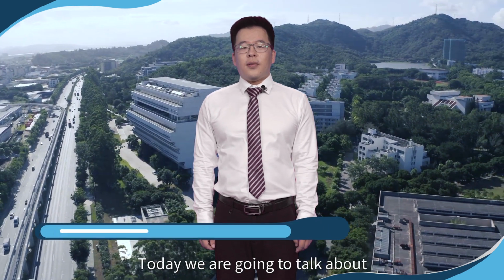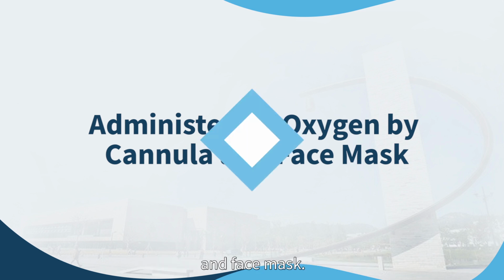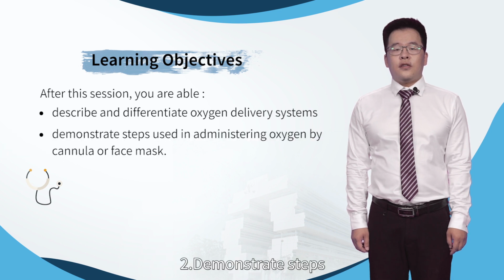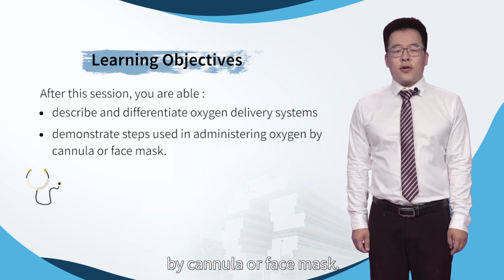Today we are going to talk about administering oxygen by cannula and face mask. Here are the objectives. First one, to describe and differentiate oxygen delivery systems. Second, to demonstrate steps used in administering oxygen by cannula or face mask.